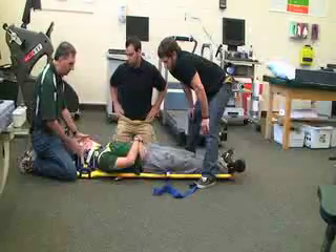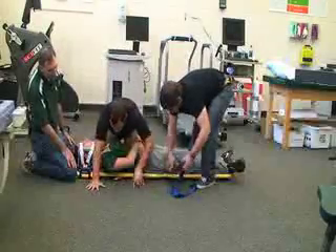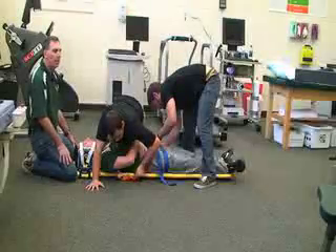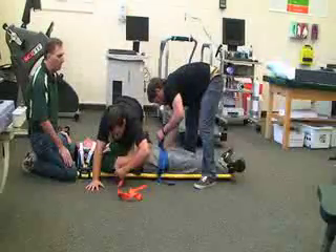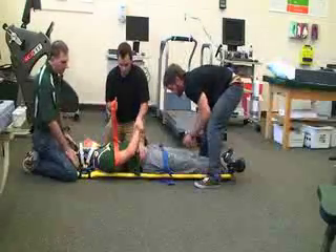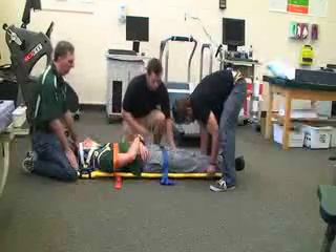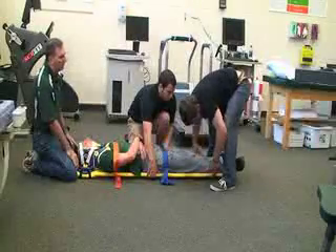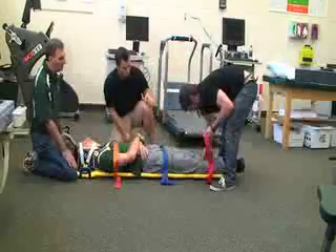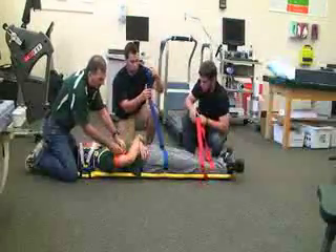Do your assessment to see if everything is okay, then once that's connected we can go ahead and buckle the straps on the shoulders. The straps on this backboard are color coded: we have a yellow one that goes across the chest — you can also cross and tie the hands — a blue strap at the waist, and a red strap down at the feet. We want to make sure that he's snug, and we can tuck the ends of the straps in so they don't get caught anywhere.